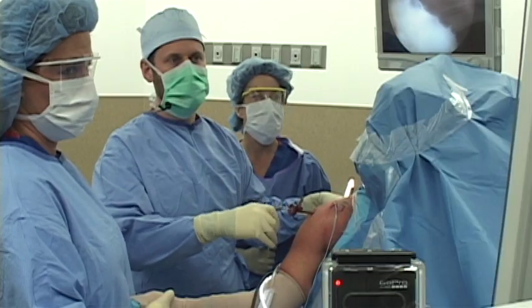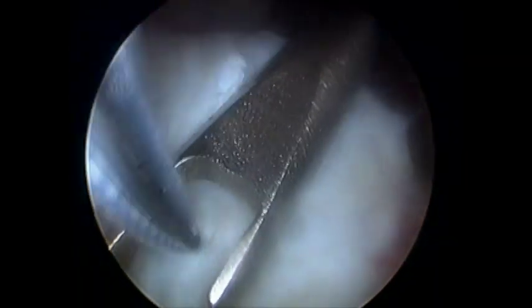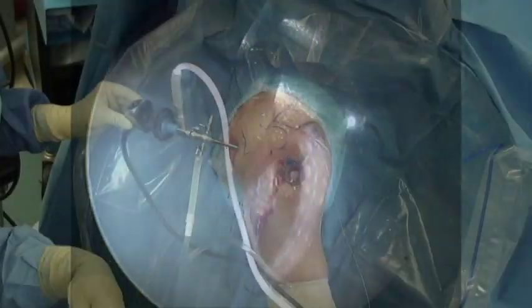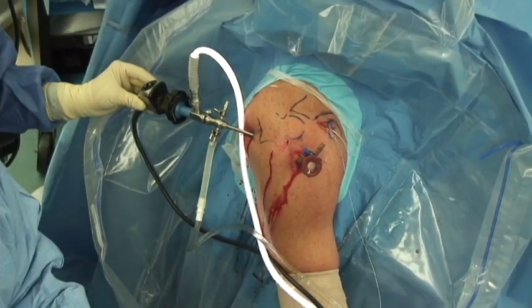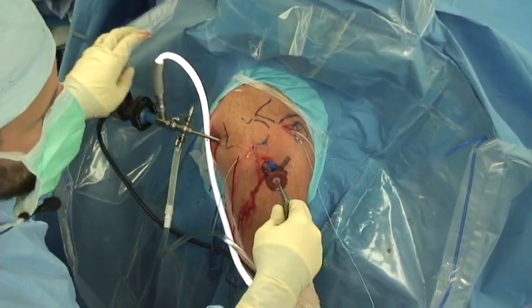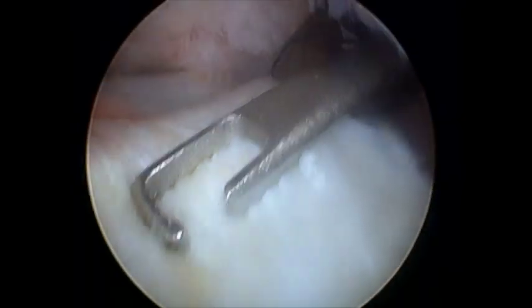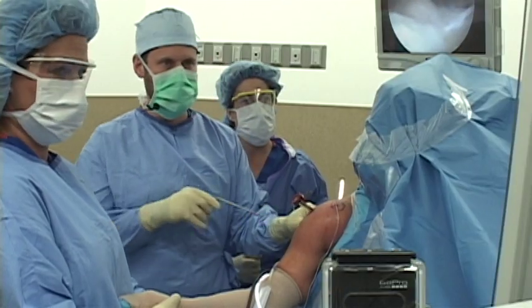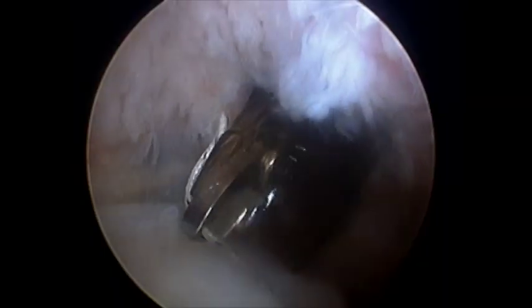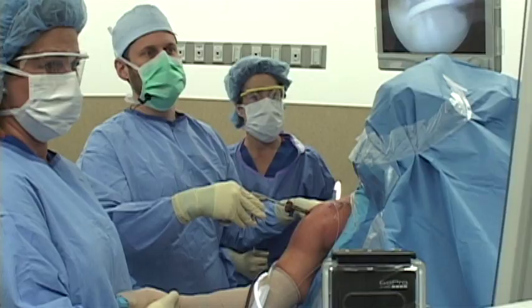We're going to grab the first stitch, pull it through our cannula, and then load it in the suture passing device, push it back down into the shoulder, and then grab a piece of the torn tendon — and this will pass the suture through. Now it's through the tendon. Now we'll grab it and pull it out, and I'll make a separate small incision to hold on to it until we need it to tie it together. Now we're going to pass its other end through the tendon, grab it, pull it out through the cannula, and repeat the process. We're doing this a total of four times — four stitches through the torn edge of the tendon to repair it.